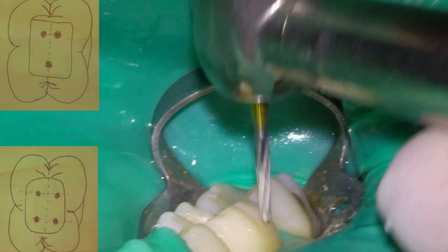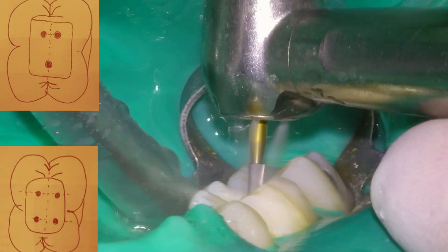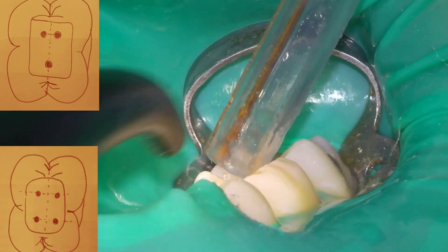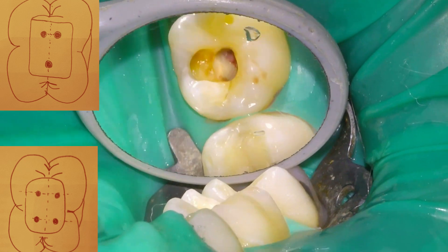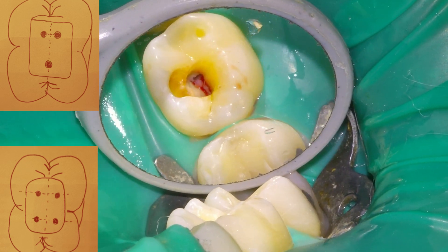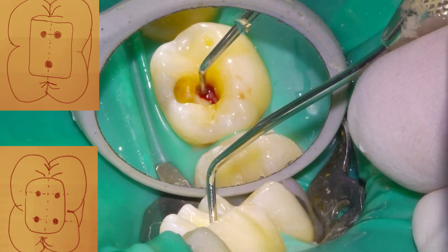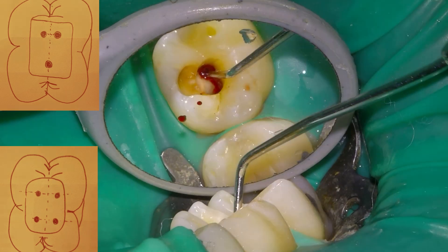When accessing lower molars, the Krasner and Ranco laws of symmetry must be kept in mind. If a line is drawn in a mesial-distal direction across the center of the floor of the pulp chamber, the orifices of the canals on either side are perpendicular to it and the orifices of the canals on either side of the line are equidistant.